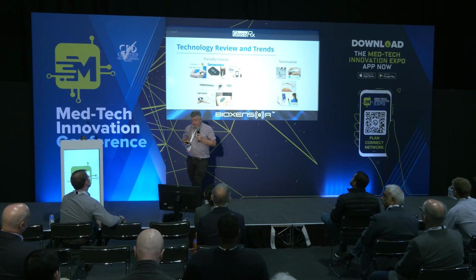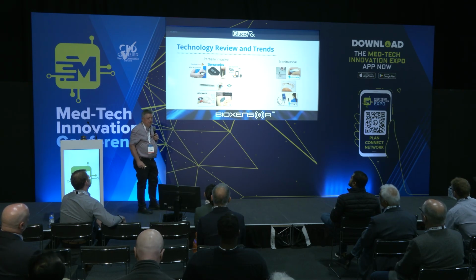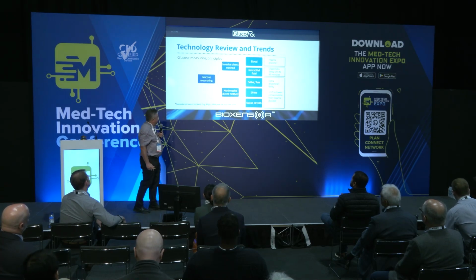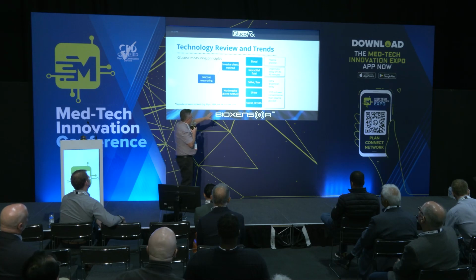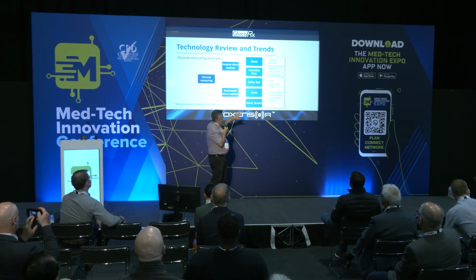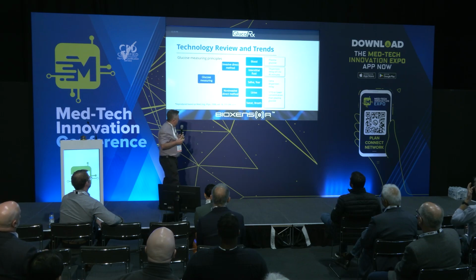So obviously this is quite a difficult problem, and it's by far the most difficult problem I've ever had to deal with in my research career, actually. But we're getting there. So we're looking at this, you see, you've got the various types of fluids that you can access, and you really want to get at the blood. You don't want to be working with sweat, breath, urine, simply because of the delay involved. So how do we get at that blood?